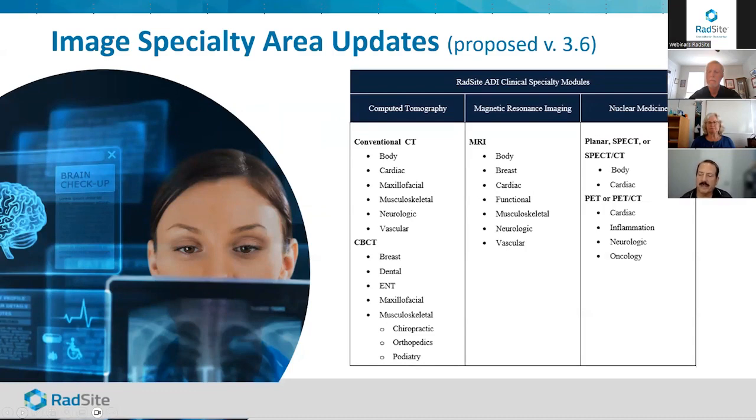For example, for ENT imaging, people are increasingly doing cone beam scanning, or for extremity imaging. And yet, how does that compare with, say, conventional CT from a radiation and quality perspective? And so those are a couple of differences.